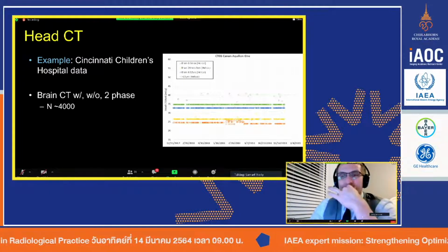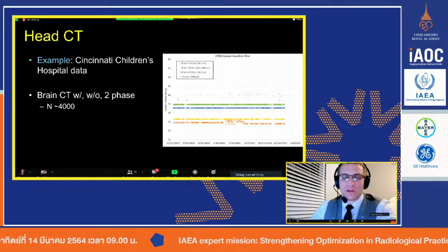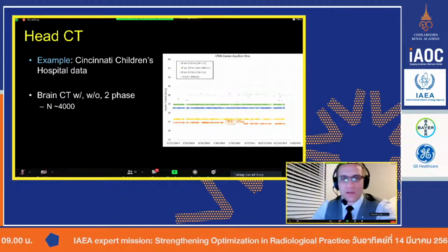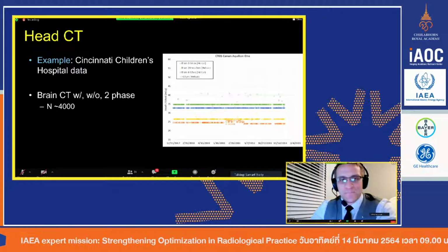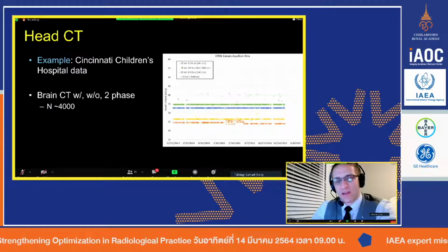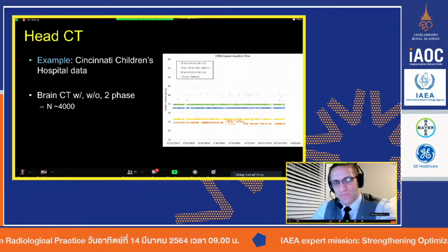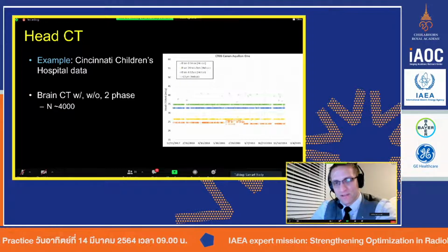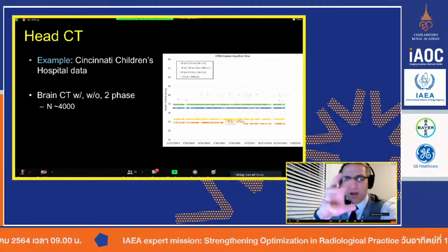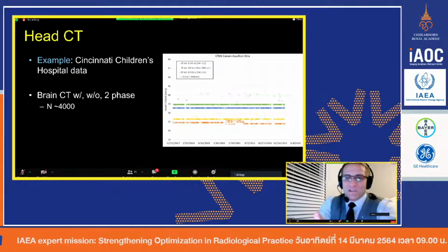All right, so those are a couple of the different ways to apply dose optimization when we're talking about imaging in the brain. So I'm going to give 2 examples of how we apply the DRLs to our own personal hospital data, and how we can set alert levels so that you can, as an optimization team, know where to operate and how to make the biggest impact.